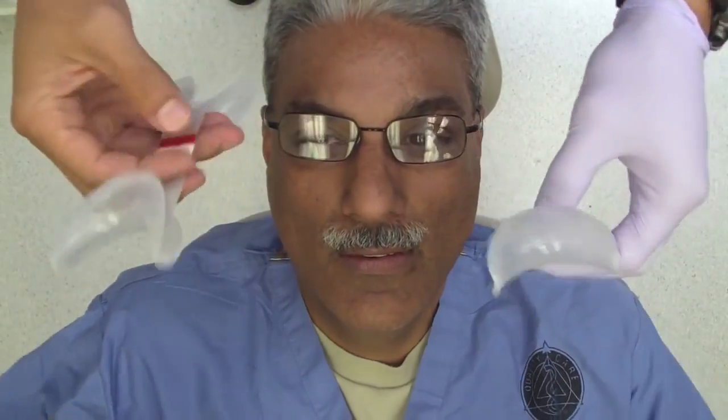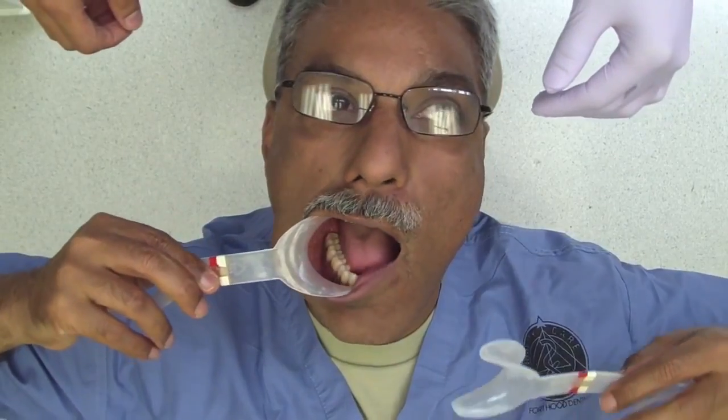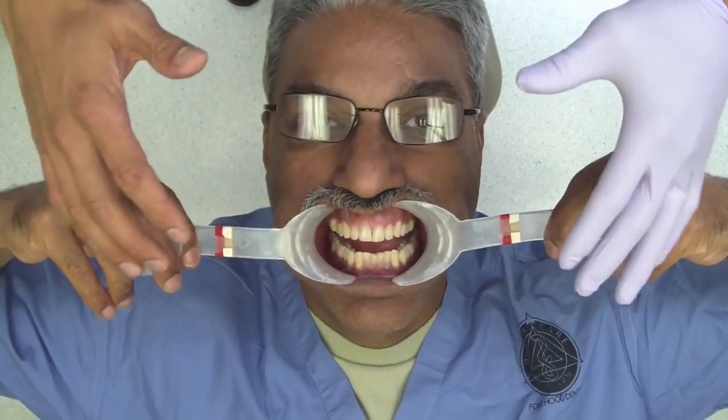Okay, so now we have the patient laying back, supine in the dental chair, and typically what I do, everyone has their own different ways. They have their dental assistant to retract. I get the patient retracted, just give them retractors. He knows how to place them in, but some folks, obviously the first time, don't know how to. You can play with the positioning of the retractors and a whole different little things. I'm just going to show you what I've come up with.